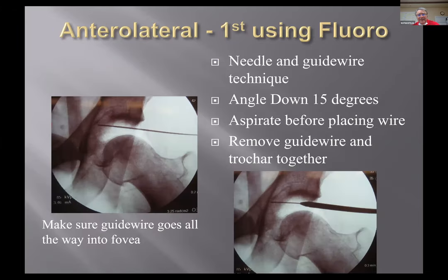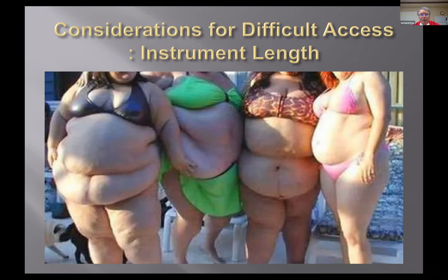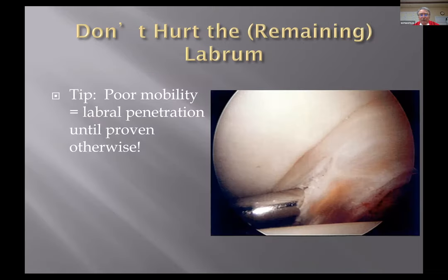So again, this needle's actually kind of high. I'm wondering why that picture's there. It might even be through the labrum. There's no way to see that until you're in. We put a switching stick, we put our scope in. You are going to have issues with big people. You have to move your portals a little more medial if you have bigger patients and use some longer instruments.